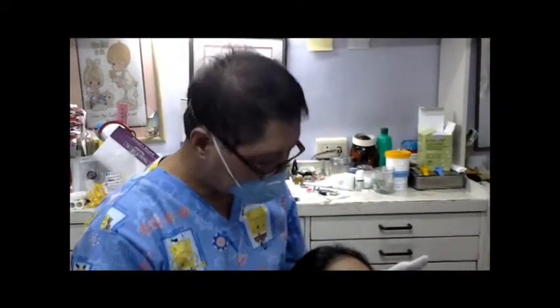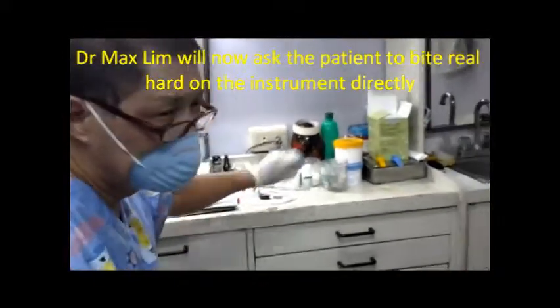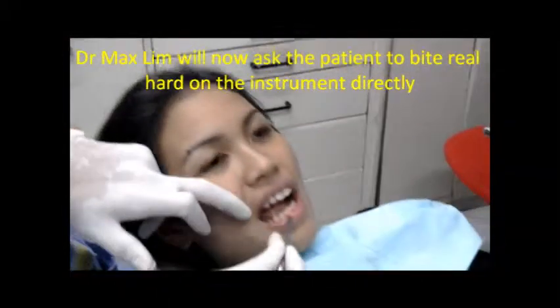Hello, we are here to test how strong the veneer of our patient is. I'll do a stress test — let her bite at it and see how strong it is. I'll use this instrument for her to bite on it.